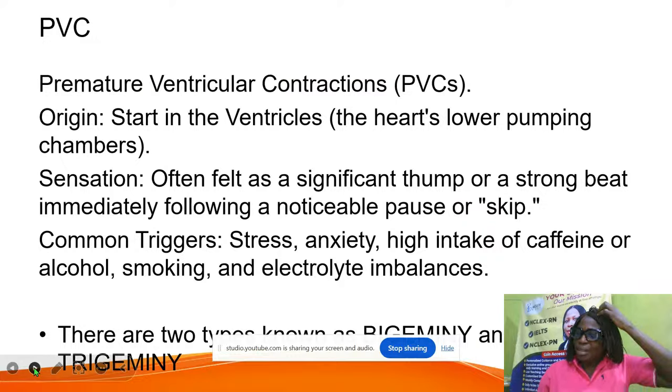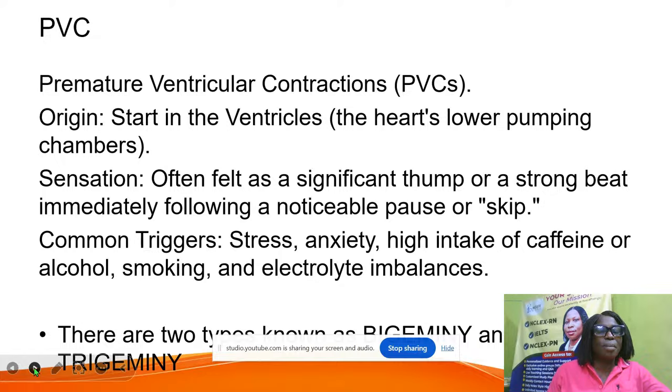PVC is that type that most times NCLEX can freak for. You know why? Because of the bigeminy and trigeminy. Now, what is PVC?